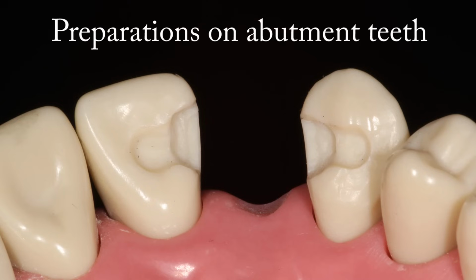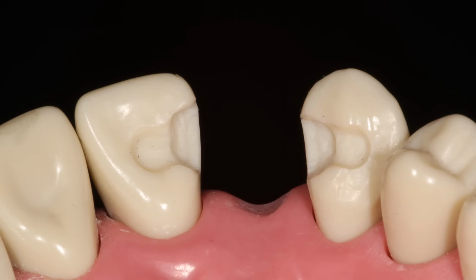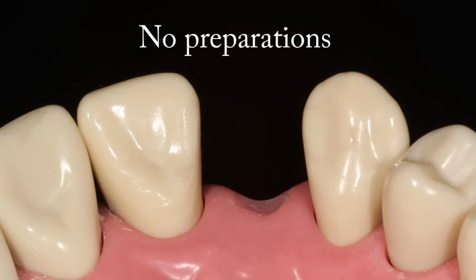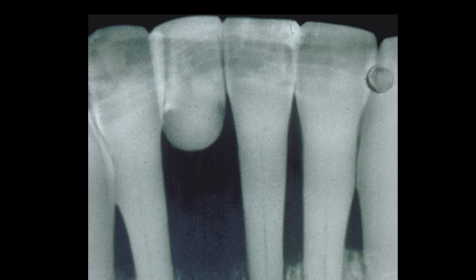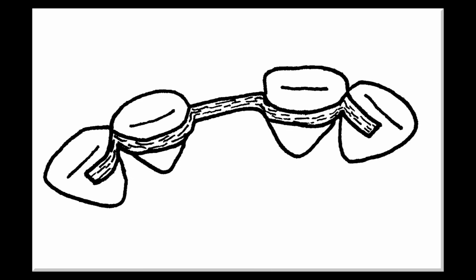A ribbon bridge can be made either intra or extracoronally, depending on the particulars of the specific case. This video shows a case without preparations to the abutments. Whether preparations are used or not, the technique for making the ribbon bridge is more or less the same. If the abutment teeth are periodontally mobile, the ribbon wings can be extended to multiple abutments.